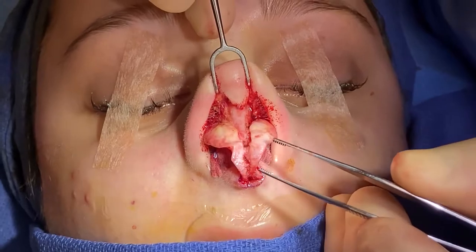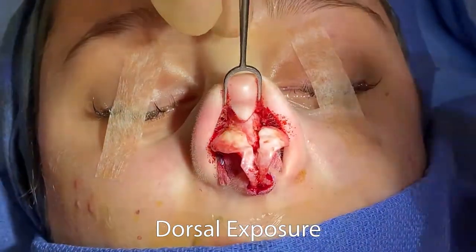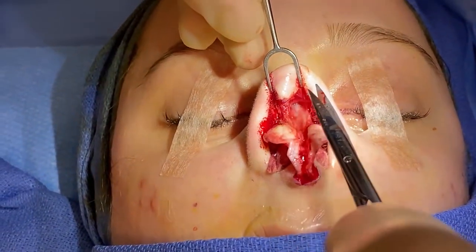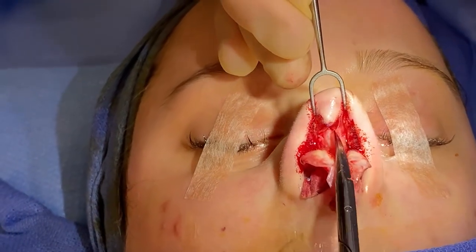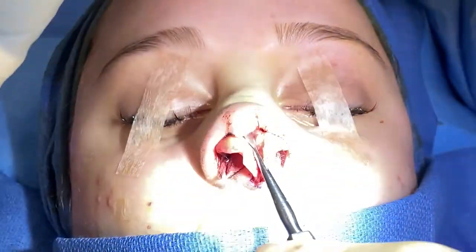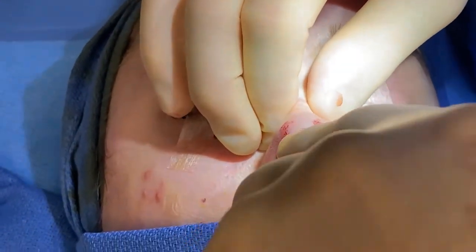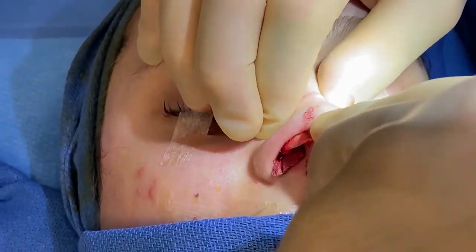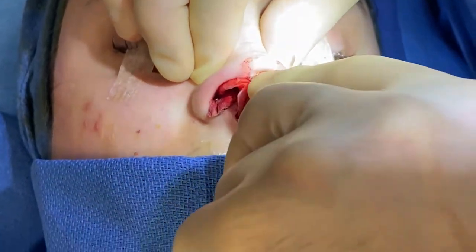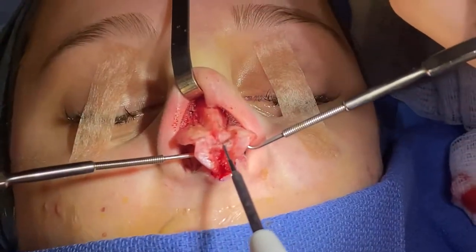She has a very weak, short middle crus — concave lower lateral, flat on this side. With scissors we go right onto the perichondrium on the dorsum. Spread, then go to the keystone area and stop. Then get the Joseph elevator and go right sub-perichondrial onto the dorsum, right and left along the dorsal aesthetic lines.